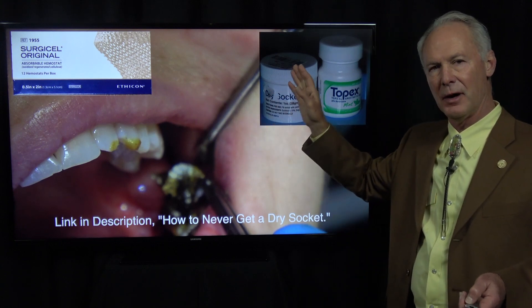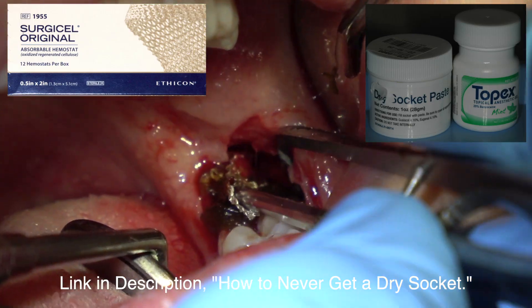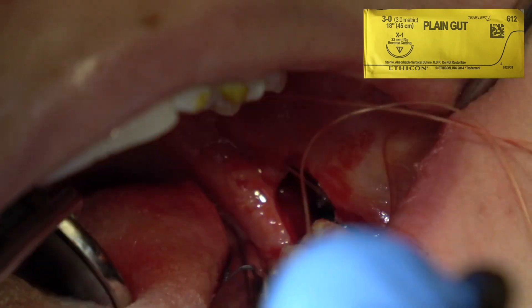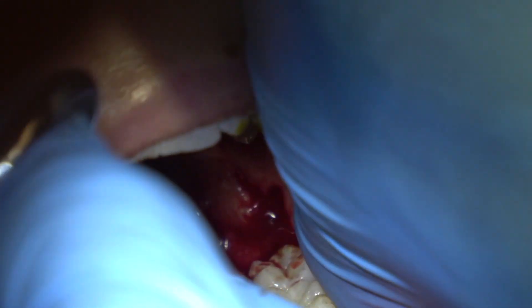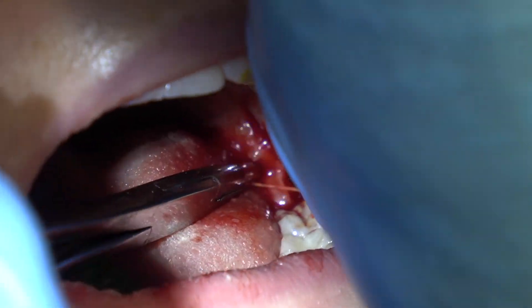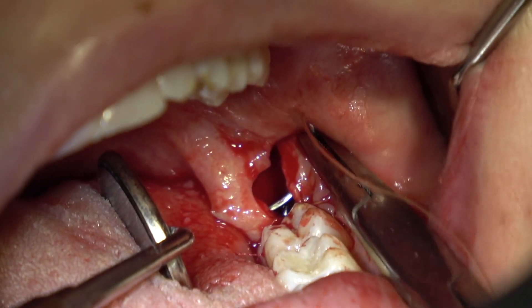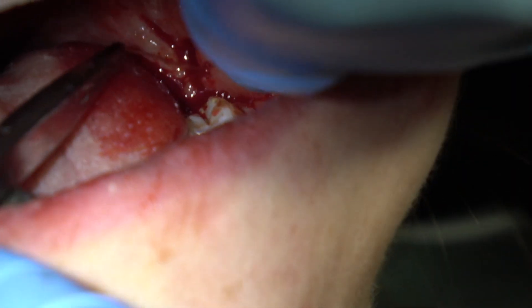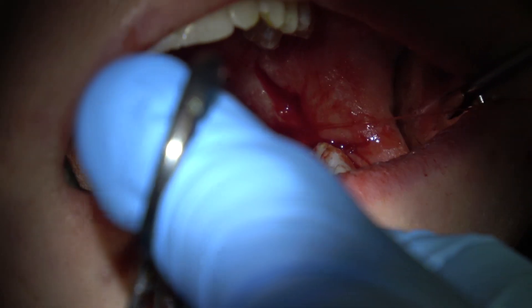Always pack those sockets with resorbable gauze and dry socket paste. I normally place two sutures to pull the flaps together in the lower wisdom teeth — this is 3-0 gut suture because you've got more of an incision here. Just one suture to close the flap in the maxillary wisdom teeth. 3-0 plain gut suture. That suture will resorb in about a week.